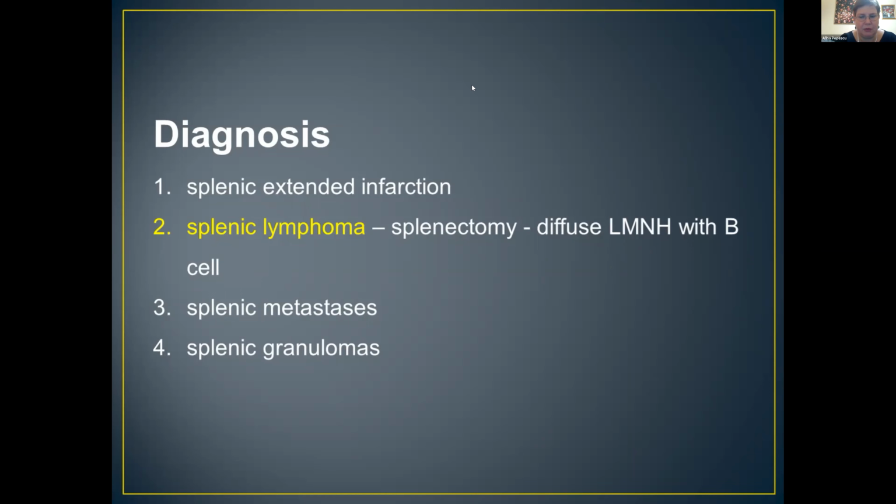But what I wanted to ask you is, because it happened to me in clinical practice, I had a patient that had anemia and had a large spleen. A CT scan was performed that said that the spleen is large, and that's all. The contrast enhanced study was pretty much the same as the image that you have shown us.